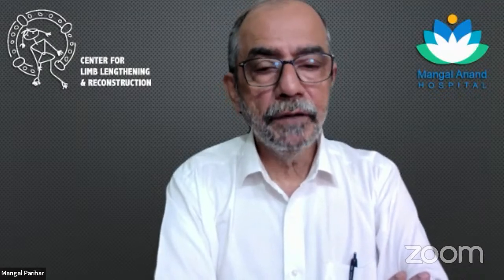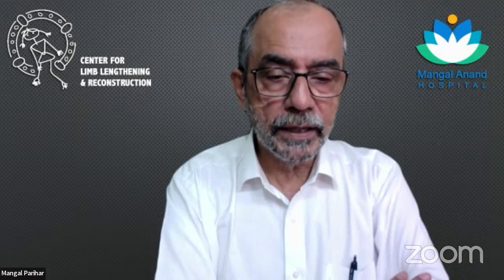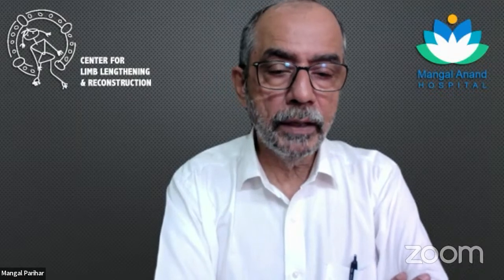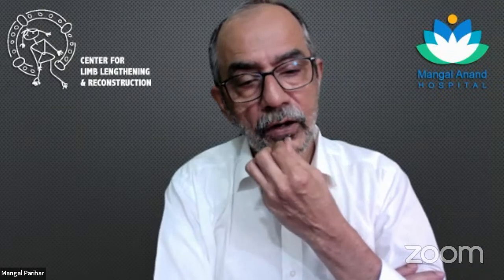And even if it's a relatively small correction that I'm doing with a fixator, I will add a debridement if there are significant osteophytes already.